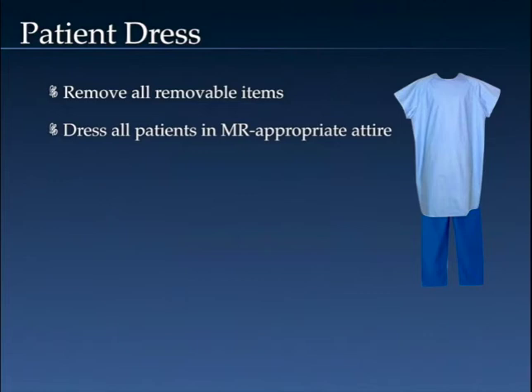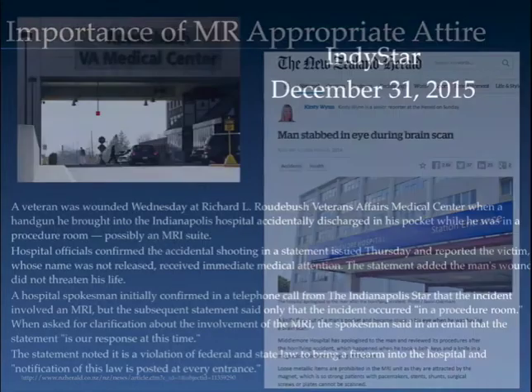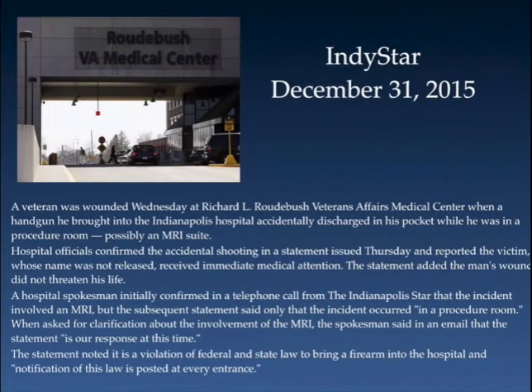Let me show you some examples. This is from New Zealand. It's an incident that occurred when a knife flew out of a man's pocket and hit him in the eye. And as I understand it, did some damage to his eye. Here is a report of an incident that occurred at a veterans hospital in Indianapolis, 2015. A patient came in. My understanding was he was in sweats, and they simply interviewed him, screened him, put him on the table, took him into the room, and unfortunately he had a gun in his waistband and it discharged.